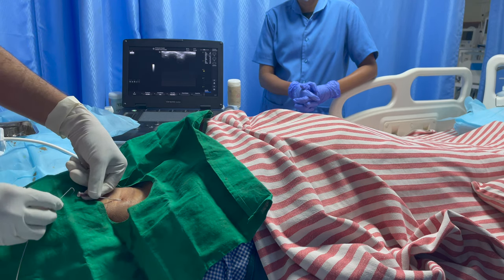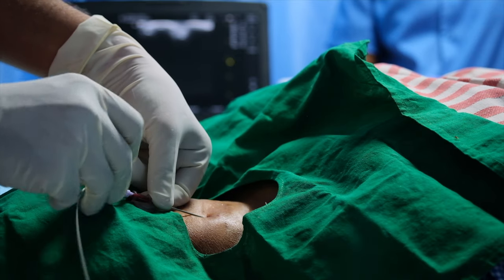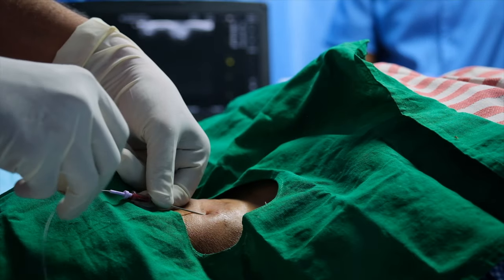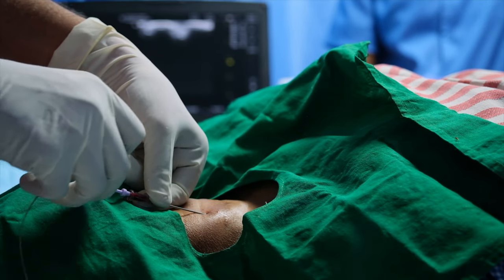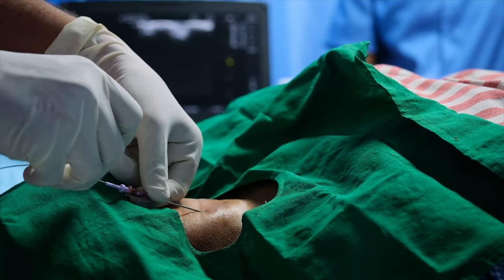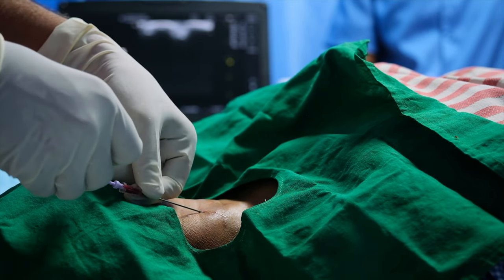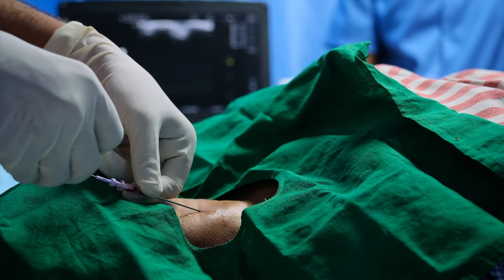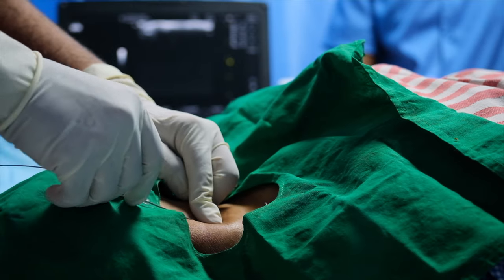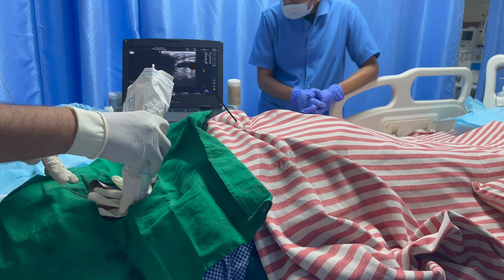Slowly remove the needle and apply adequate pressure to stop arterial hemorrhage. Now start inserting the guide wire slowly and gently to detect any obstructions — it should pass ideally without any resistance. In case of obstruction, withdraw the guide wire and reassess the needle puncture site. Once the guide wire is placed, confirm its presence in the vein with the ultrasound probe. At this point, if the ECG monitor is connected, it may show occasional ectopics or arrhythmias.